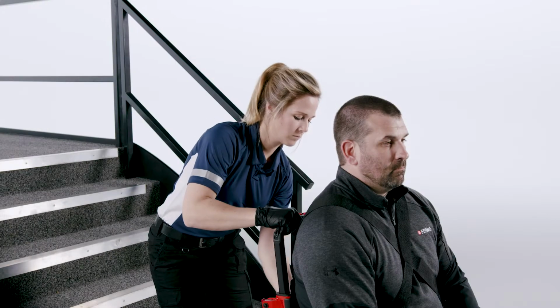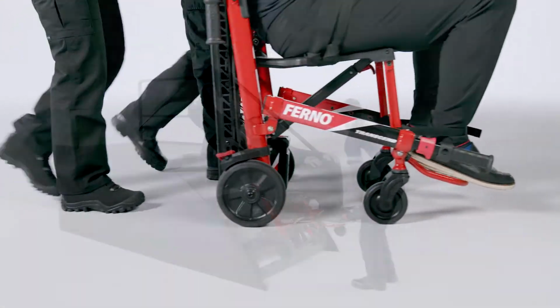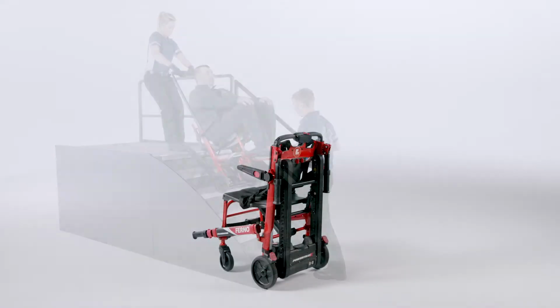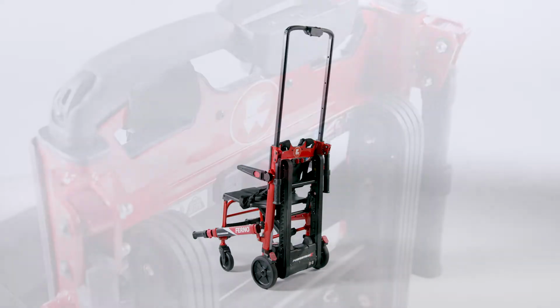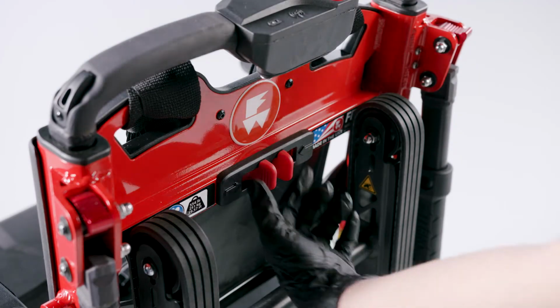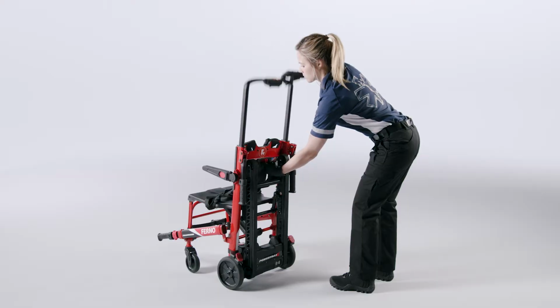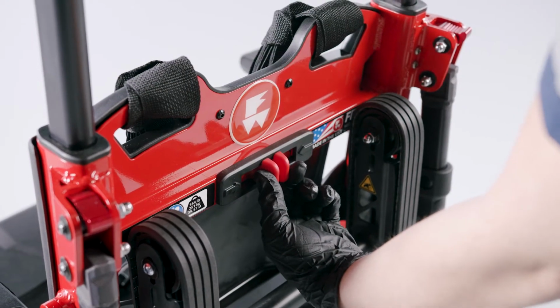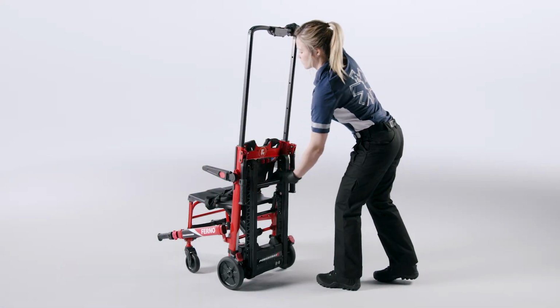The lift bar is used to guide and steer the chair when rolling on the ground or floor, and control the chair on stairs. The optional extending lift bar adjusts to 5 locked positions. To unlock, squeeze and hold the red release tabs together. Then, raise or lower the lift bar. To lock, let go of the release tabs and raise or lower the lift bar until it locks into position.